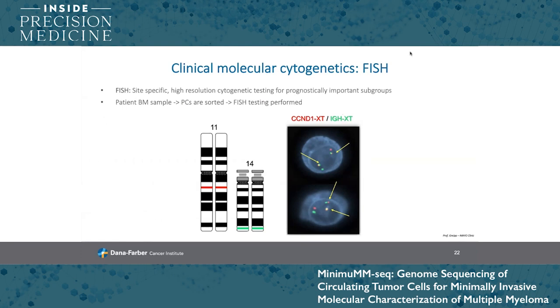In the example below of a primary translocation of t(11;14), you can see when chromosomal arms don't have translocations that these light up as either red or green. However, in tumor cells where chromosomal arms do have translocation events, these probes come together and light up as yellow, as indicated by the arrows in the figure to the right.